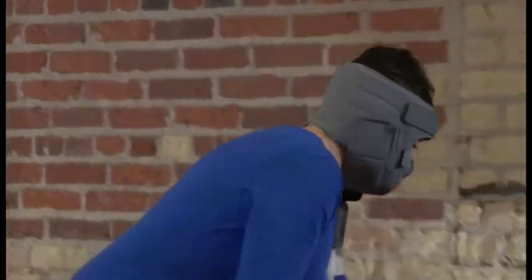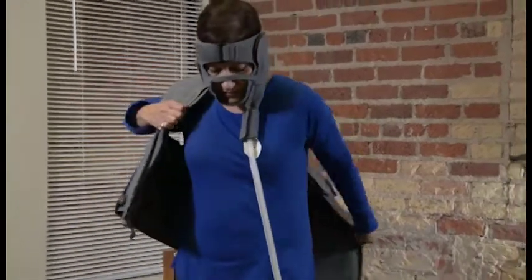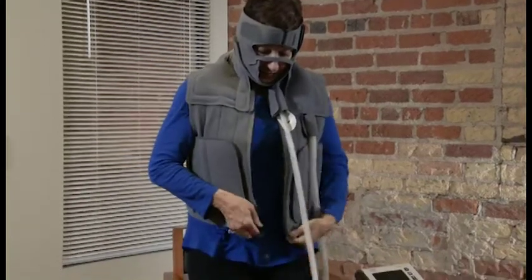To apply the vest garment, slide your arms through the armholes as you would a jacket. Align both sides of the front zipper and zip the garment up completely.